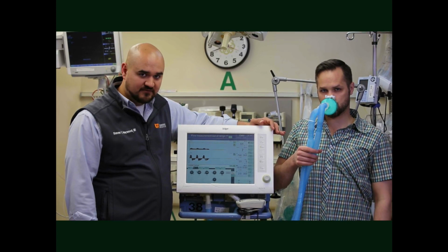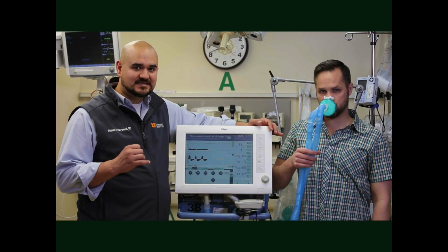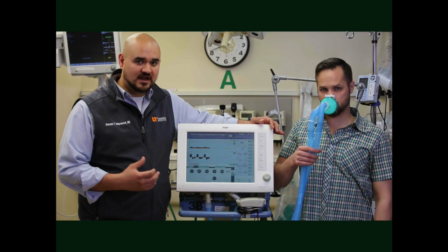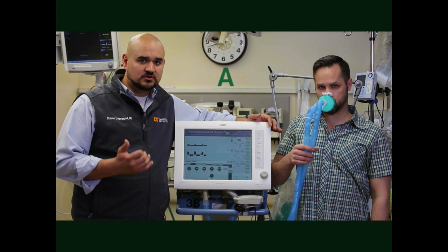And then finally, your FiO2. You want to give the lowest possible FiO2 to maintain a saturation of 90%. Oxygen is a drug that if used inappropriately is harmful. So I typically start at 30% FiO2 when I can. As you go up on your FiO2, also go up on your PEEP.